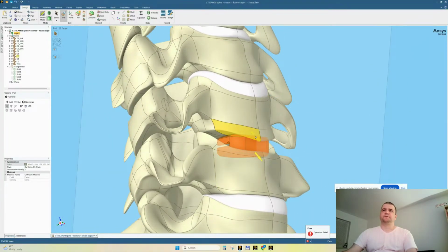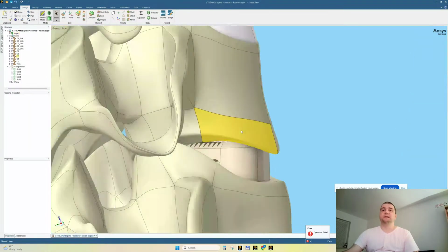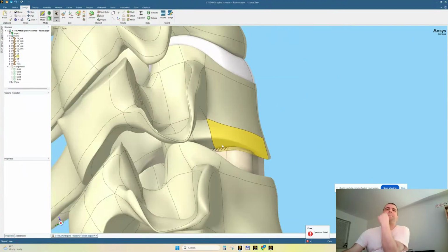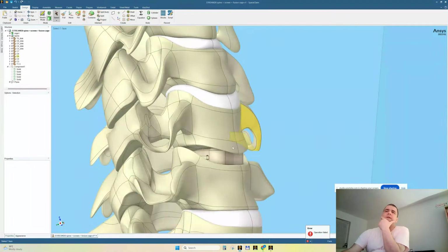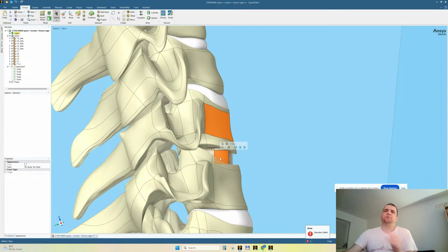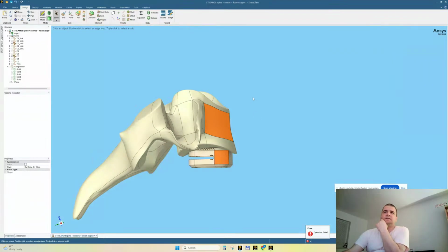This is a little too much for me. What I mean is I would like to cut this one. Let's see if I can cut. Let's keep only these two parts with Ctrl pressed, hide others.